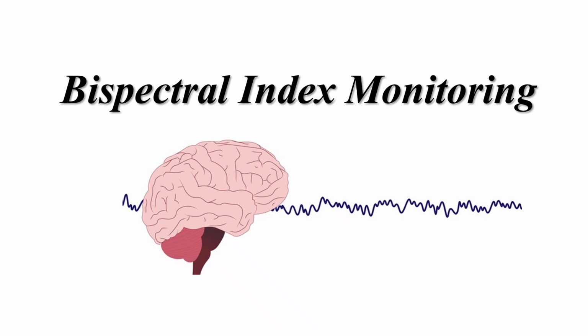Today we will discuss bispectral index monitoring, or BIS monitoring. BIS monitoring measures brain activity to help assess a patient's level of consciousness during anesthesia or sedation. It provides a numerical value that guides safe sedation levels. So let's start with the introduction.